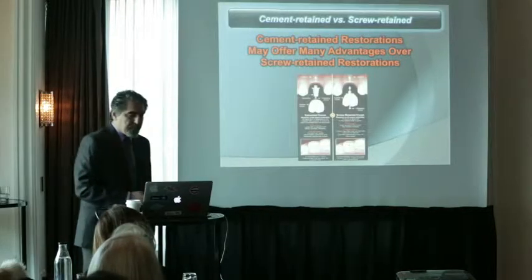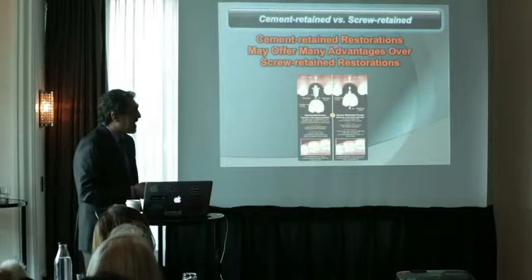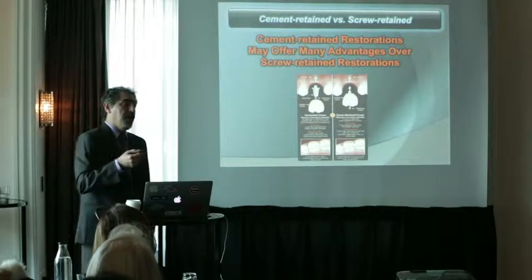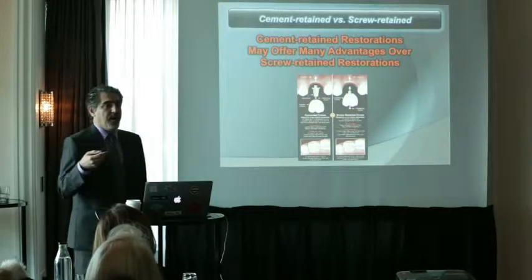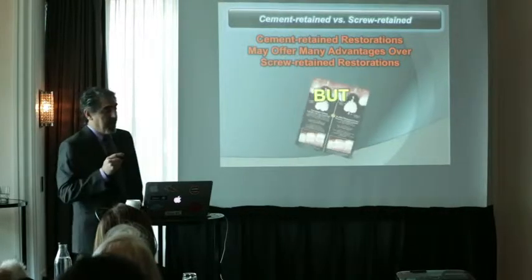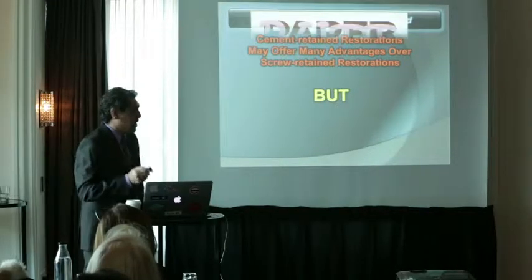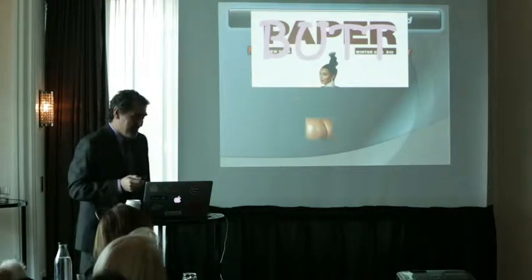Now, when you look at that, you will see that with the cement-retained, you have this advantage. Much more convenient, prettier, less screw loosening, all these sort of advantages. But, and it's a very big but, that you have to remember.